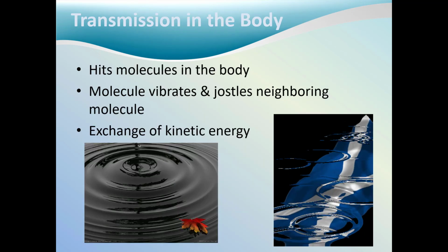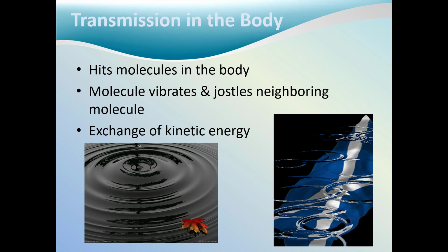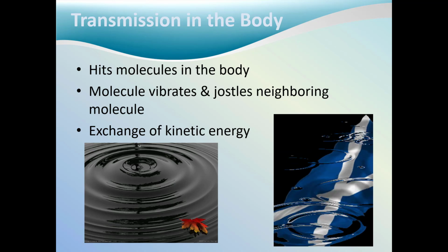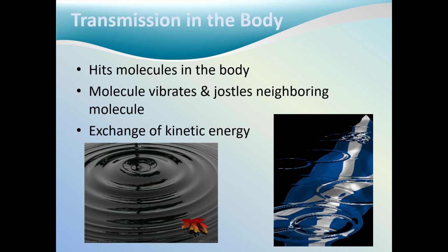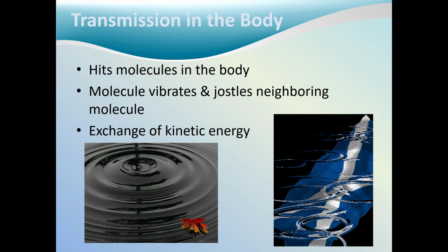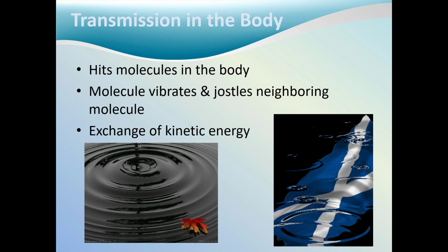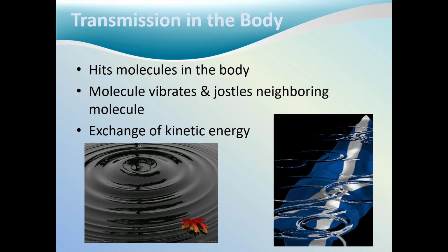Ultrasound transmission occurs to tissues in the human body. Acoustical energy is transferred by one molecule colliding with another, and in the process exchanging kinetic energy without actually displacing the molecules. Consider a leaf floating in water. If a pebble is dropped near the leaf, it will bob up and down as the water ripples past beneath, but does not disrupt the leaf.